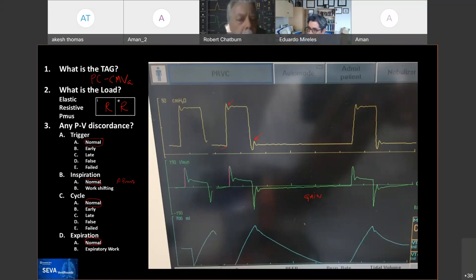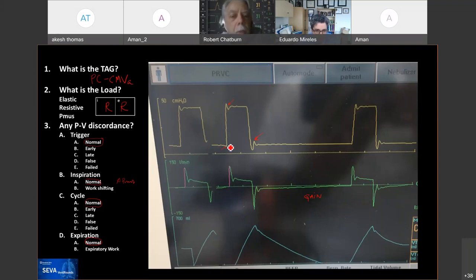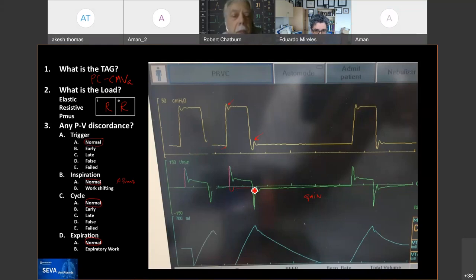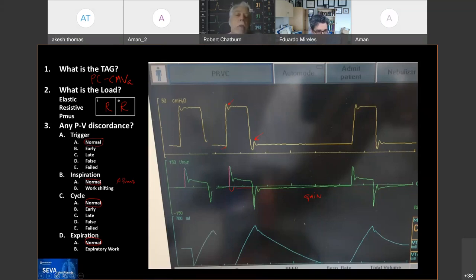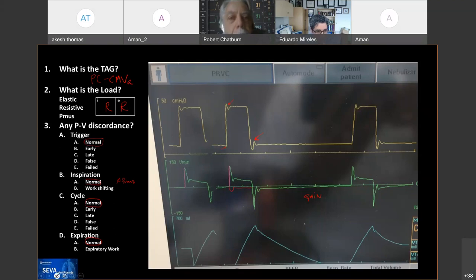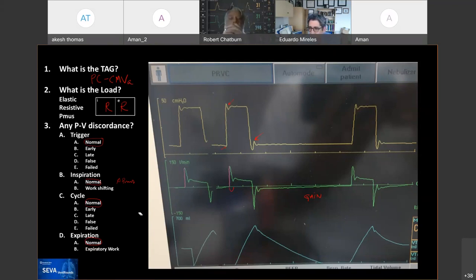Rob adds: if those first two breaths were actually patient-triggered, there must have been some P-mus. But the P-mus was very short-acting. Strictly speaking, by how we define synchrony, this would be a late cycle — because if the ventilator was just following the patient's P-mus, like in PAV or NAVA, this might have been a very short little breath. Eduardo acknowledges the fair point, but says it's very difficult when there's nothing more than a trigger effort. Even if it was a late cycle, it's clinically irrelevant. That's how we define the majority of these things — as clinically relevant or not clinically relevant.